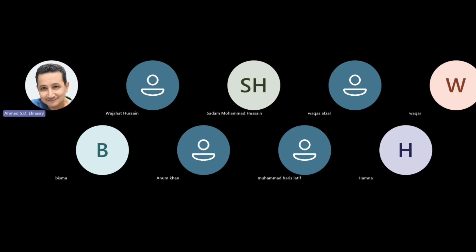Because it will increase the coronary blood flow. Yeah, but in the normal scenario, we say that if our diastolic pressure is more than 90 or 100, it's not good for coronaries. We might have an MI. But in the IABP case, we consider more than 100, 110, 120. What is the phenomenon? I'm not getting the question.